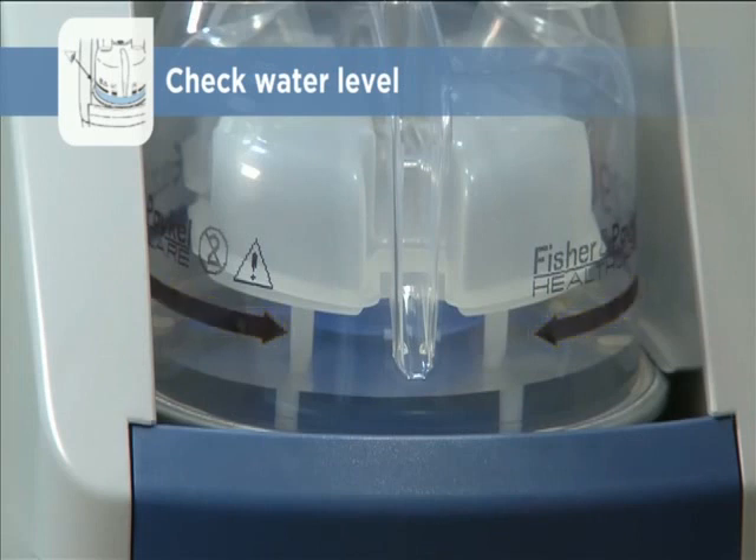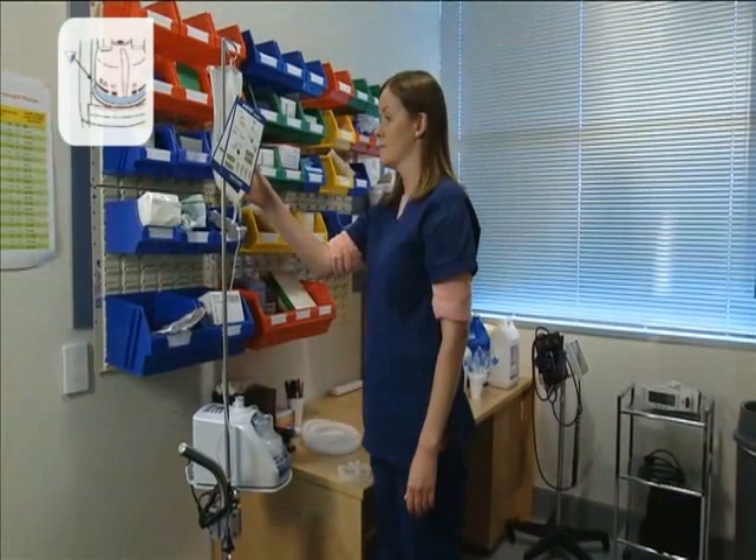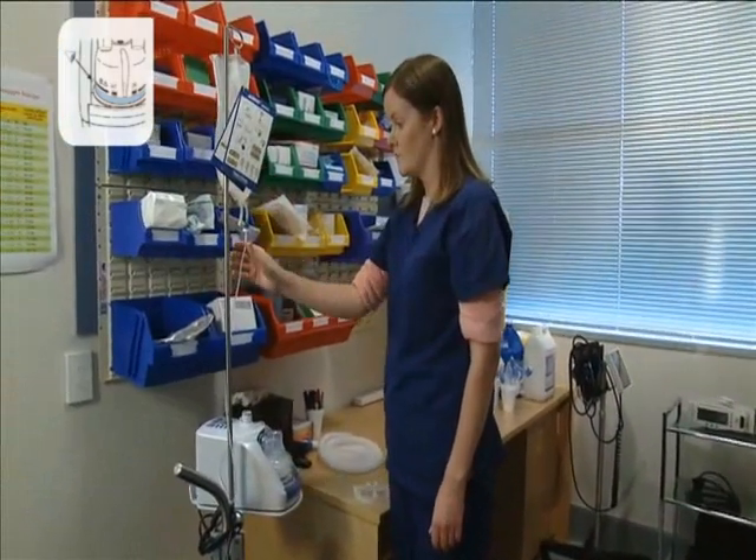The chamber maintains the water level automatically until the water bag is empty. Depending on the Evo flow rate, a 2-litre bag will last between 1 and 2 days. Check the Evo manual for details.